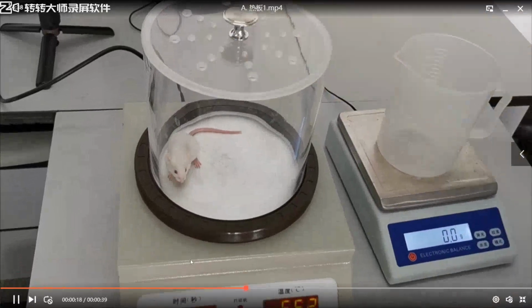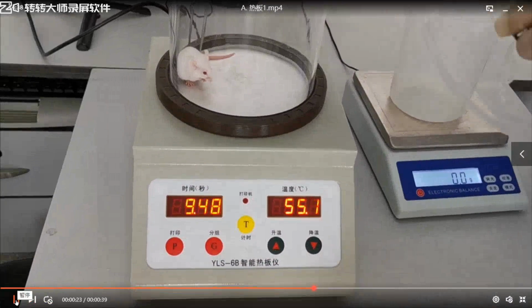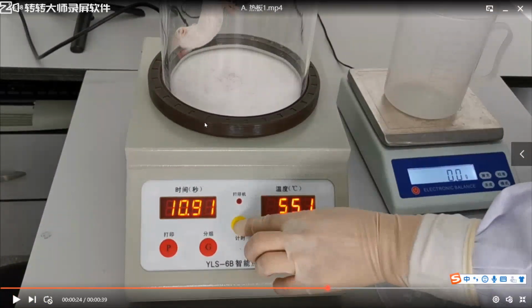Before we give drugs, we should test the pain threshold of each mouse. Okay, just now have you seen the mouse lick its hind limb? This time, 10.91 seconds is its pain threshold.